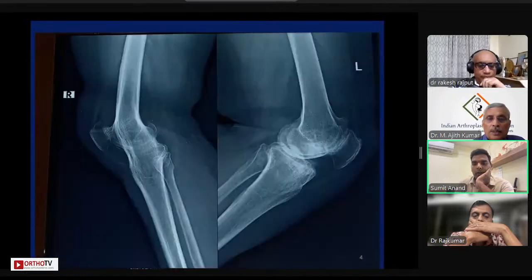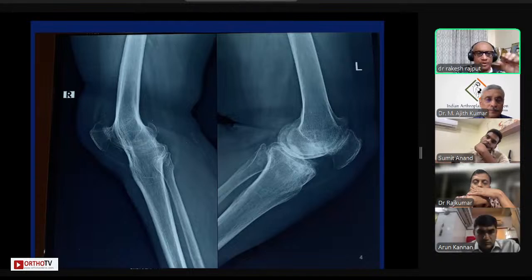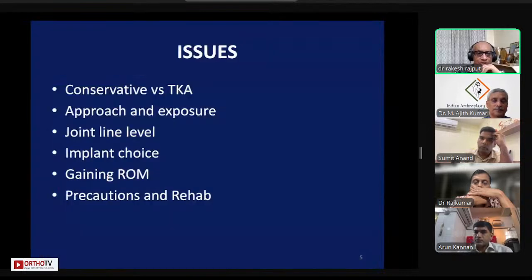Thank you, Rajesh. For me, it's a trapezoidal wedge that I normally like to take, after I cut out the patella. I didn't describe the whole way, but that's how you do it.